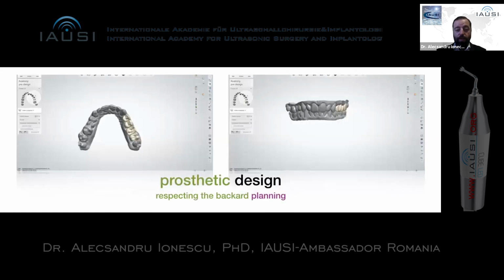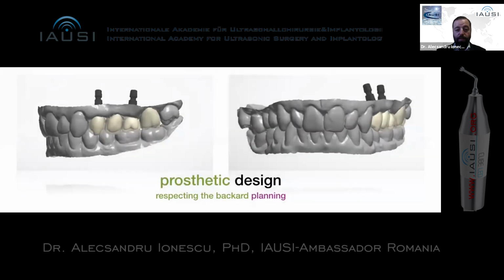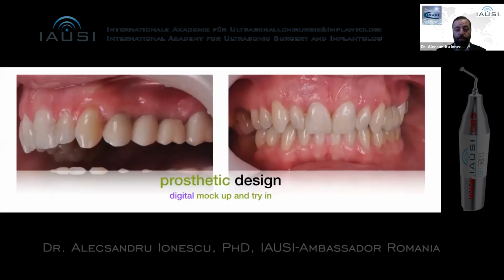Then we designed the prosthetics also in a digital way. And this is the design, very similar to what we did before treatment. I mean, it was a copy of the initial situation. Here is a digital mock-up.